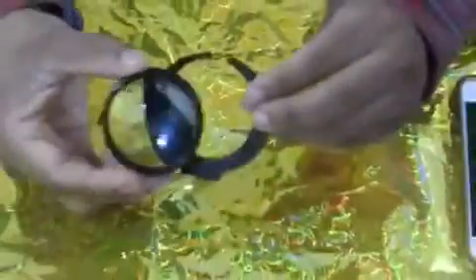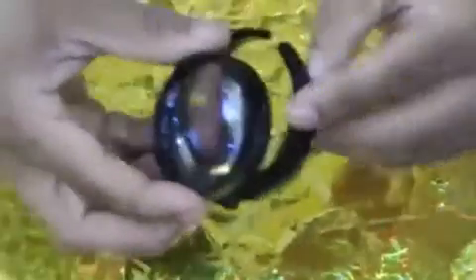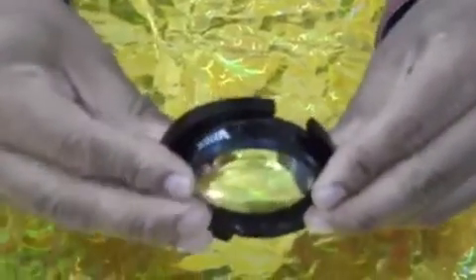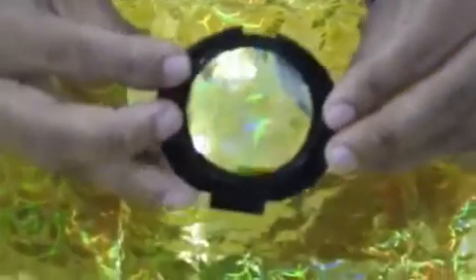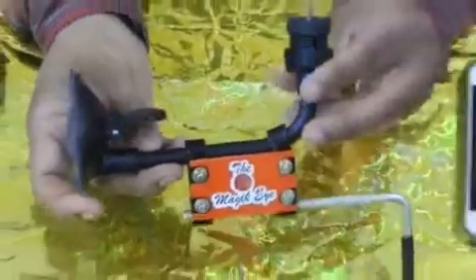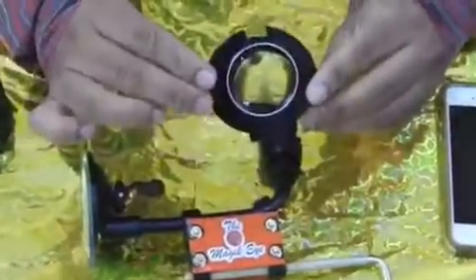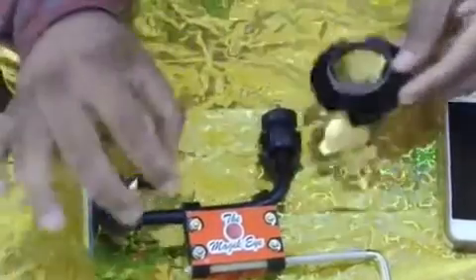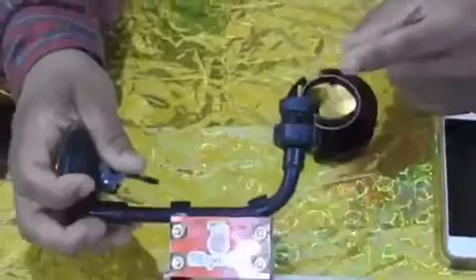This lens is fitted into the adapter by firmly pressing it along the edges. The lens holder with the 20 diopter or the 28 diopter lens is then attached to this smartphone adapter device by screwing it gently on the adapter head.